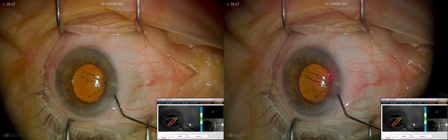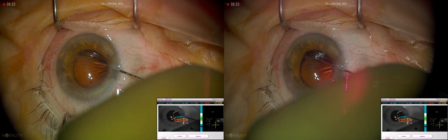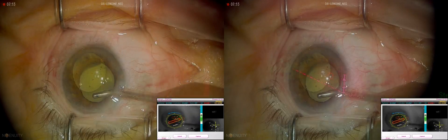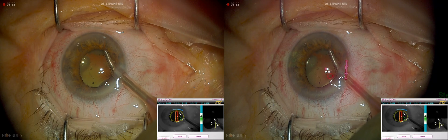This is Trimoxi made by Imprimis Pharmaceuticals. It is a combination of triamcinolone and moxifloxacin that I just injected trans-zonularly into the anterior vitreous. As I perform a dropless cataract surgery, my patients do not take drops postoperatively.